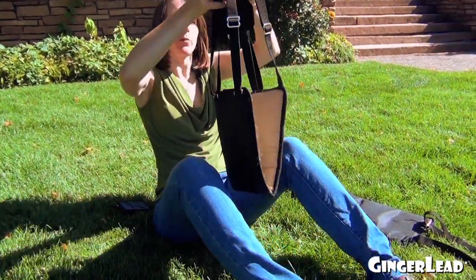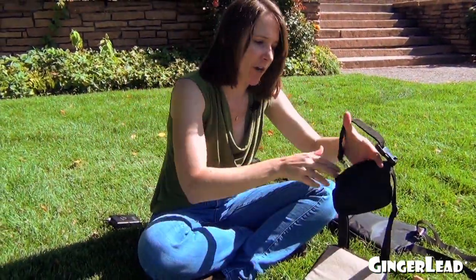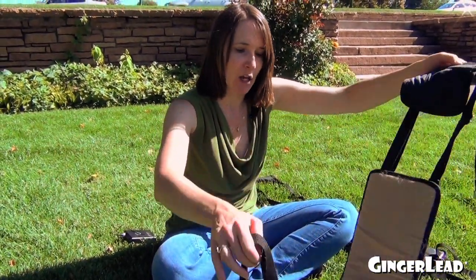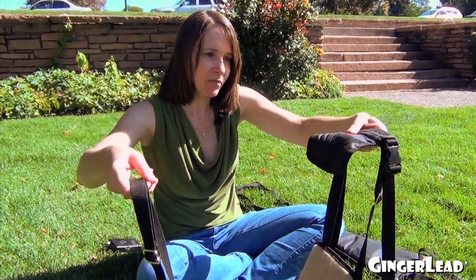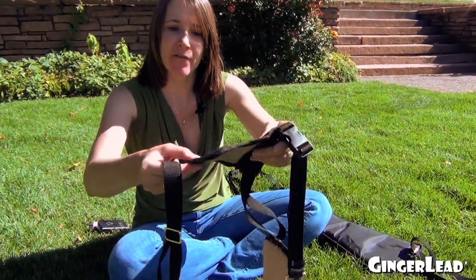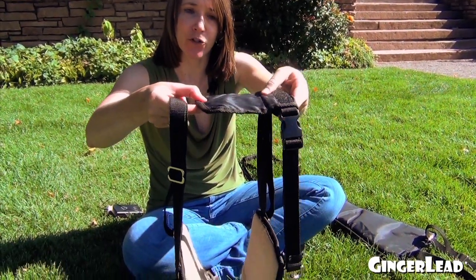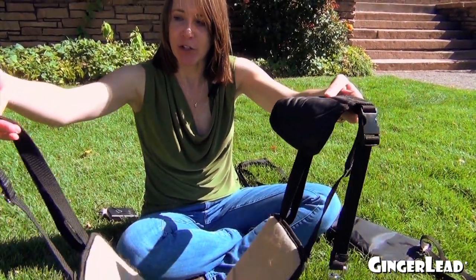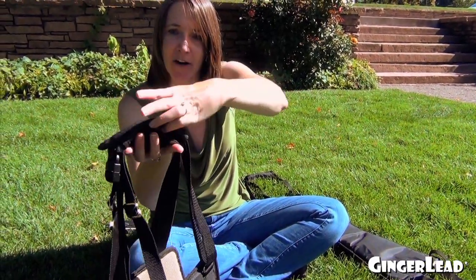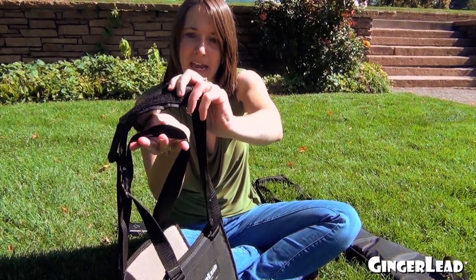Okay, now be ready to put it on your dog. To put it on your dog, you'd want to start with the handle on the left side of your dog. Bring the soft padded belly sling underneath your dog. Have the handle open with the corduroy lining facing down towards the ground or towards your dog's back. You bring the straps on the right side of your dog, underneath the handle.